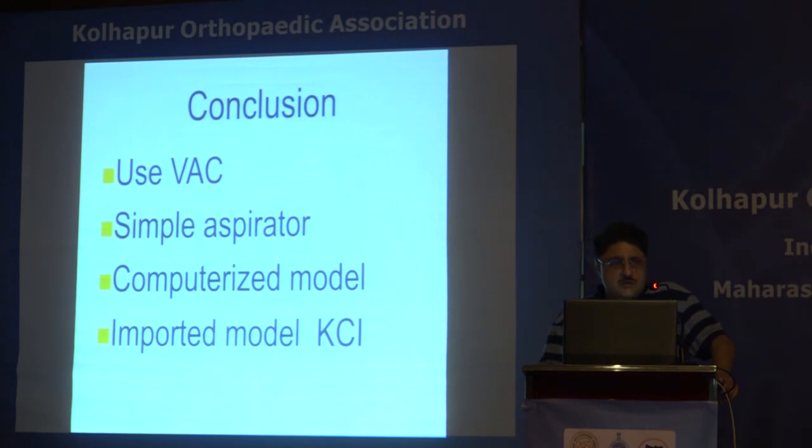So use a VAC very judiciously, and you must put the sponge in the OR, not in the ward or on a trolley somewhere around the corridors of the hospital. You must take it to the OR and change the VAC sponge under sterile conditions.